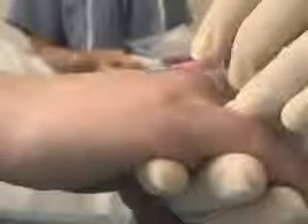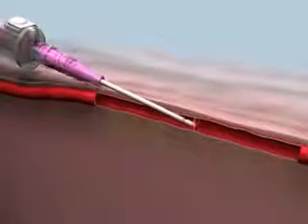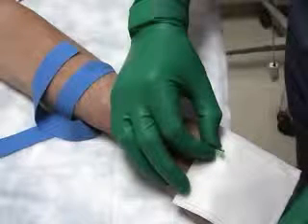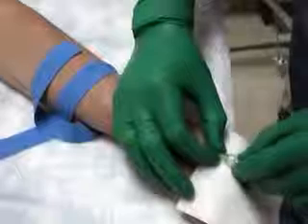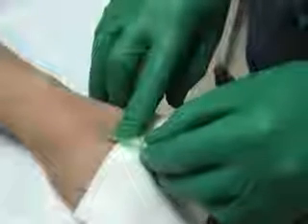into the vein. A valve within the vein may prevent advancement of an inserted catheter. If this occurs, hold the cannula hub in place, remove the tourniquet, and connect the intravenous tubing to the cannula. Running fluid into the vein may open the valve and allow the cannula to be completely inserted.